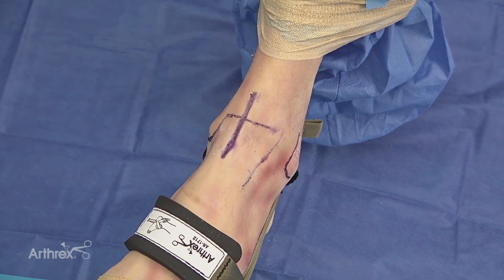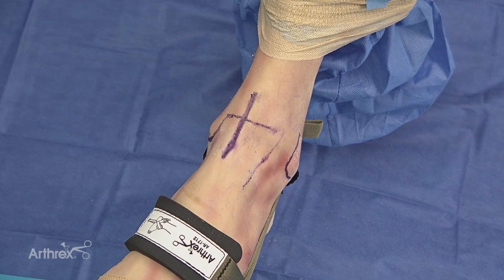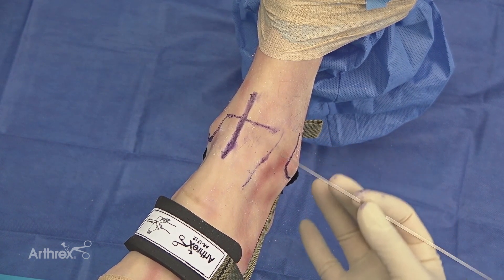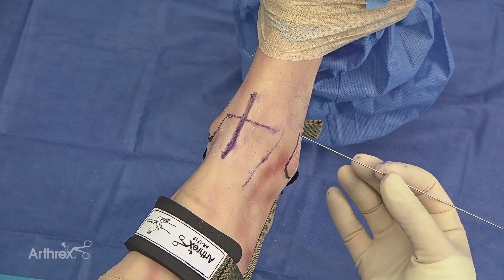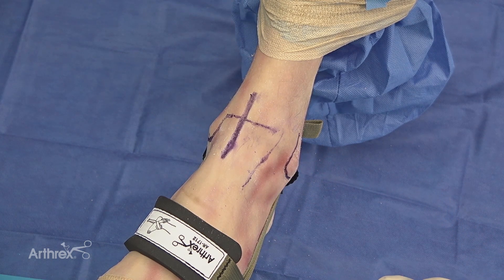Before beginning any ankle arthroscopy, it's very important to mark out the anatomy. When the patient comes into the operating room, I'll mark out the superficial peroneal nerve by doing a plantar flexion inversion mechanism, highlighting the superficial peroneal nerve which typically separates approximately 6.5 centimeters from the base of the fibula.